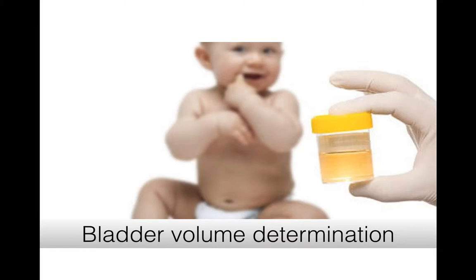Not to calculate whether it is 100 milliliters or the actual number, we want to answer one question: if I am trying catheterization, is there any urine inside? You don't want to encounter embarrassing situations. Put the catheter in, no urine gets out, everybody just looks at the tube. What's going on, right? Place that, return, wait for the urine, or remove immediately.